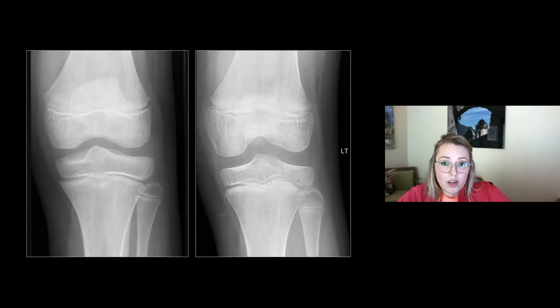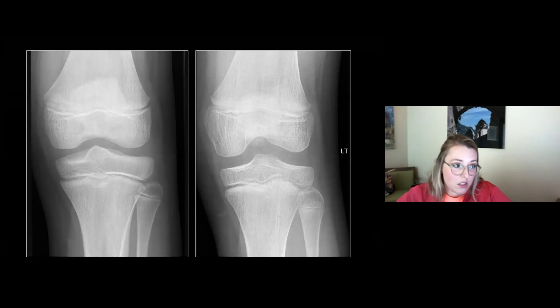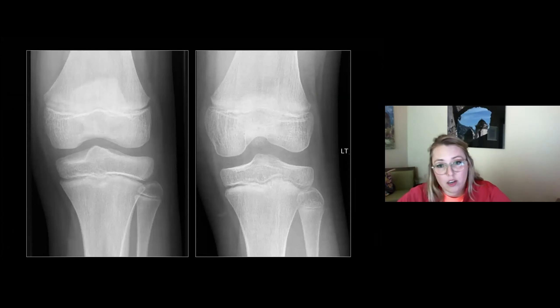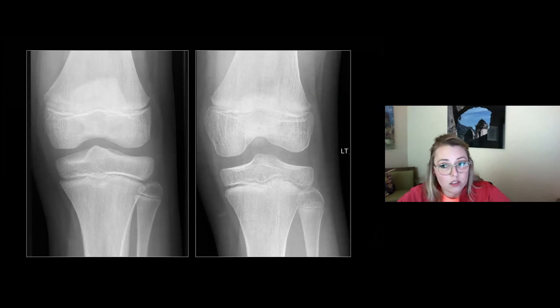These x-rays are from two different patients, and you would have a hard time finding ten differences between them — they are very similar looking x-rays. One is from a nine-year-old girl, and one is from a twelve-year-old boy.